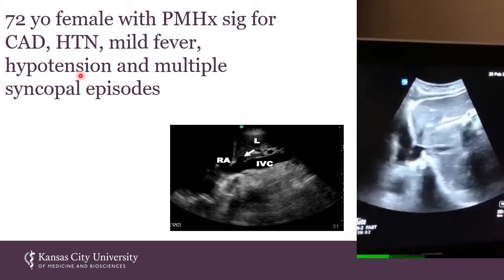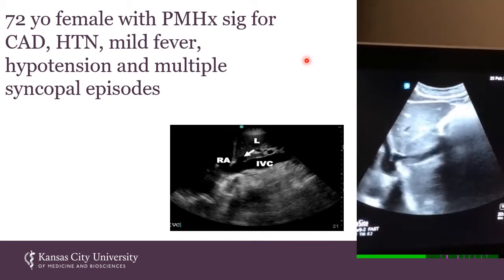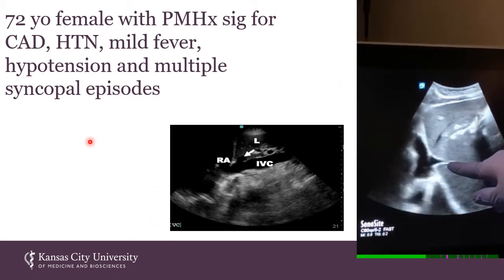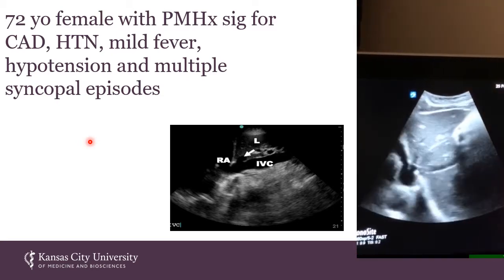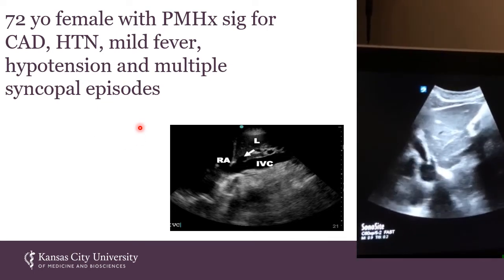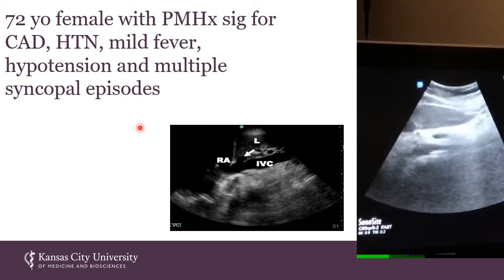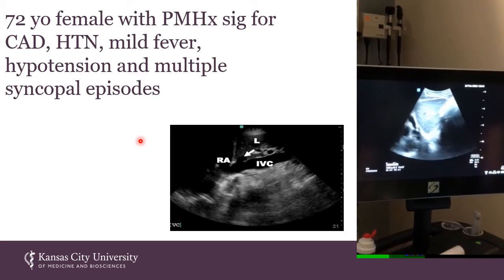And part of the workup I did on her was to just do the modified RUSH protocol that I was showing you in the previous slide, but I'm just going to show you the IVC portion of this. So when somebody comes in, they have undifferentiated shock, and they have limited ability to give you a history, you can certainly just go to this RUSH protocol and take a look. And so what you do, you look at their heart, you look at the contractility, you look at the IVC and the degree to which it's filled, and then you do a FAST scan and some other scans of the aorta, etc., and try to get the etiology of the shock.